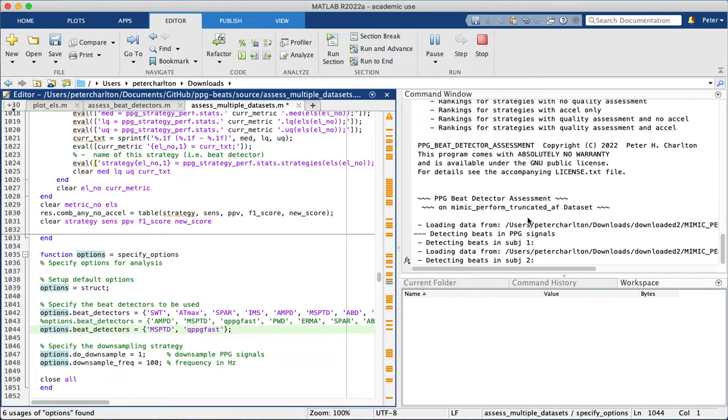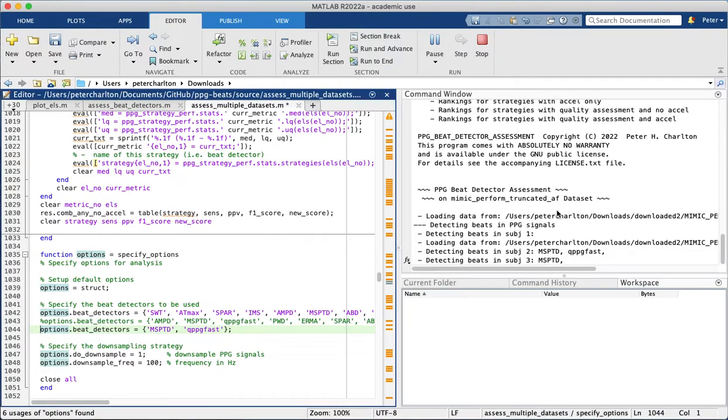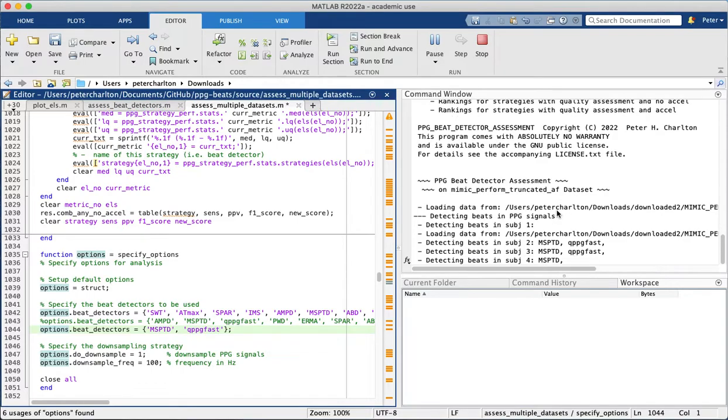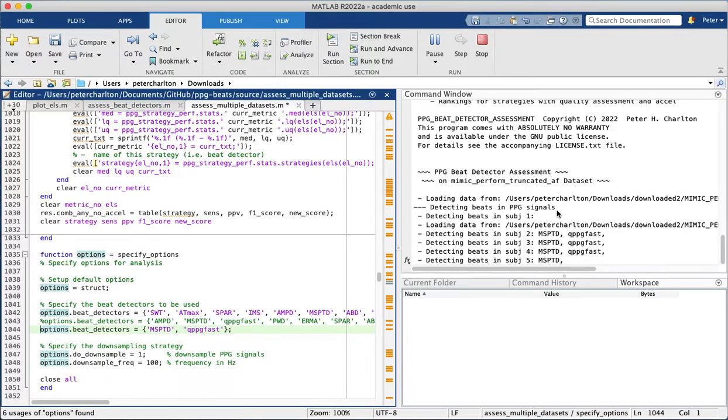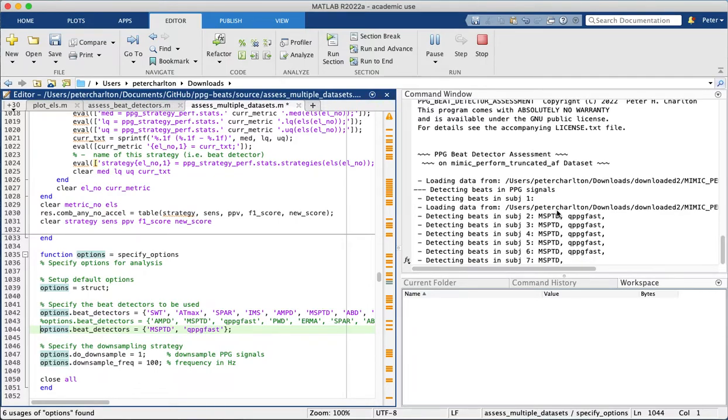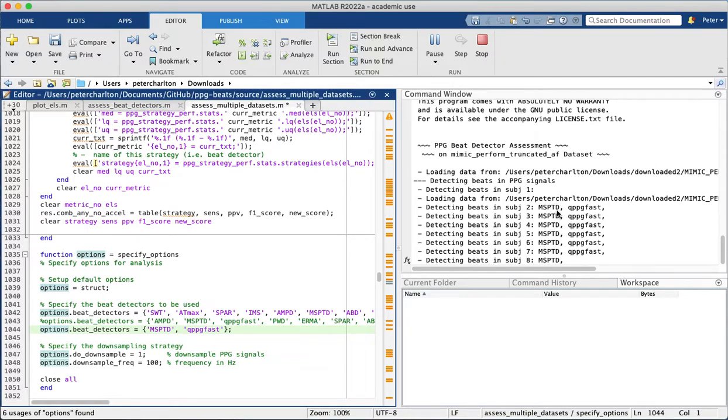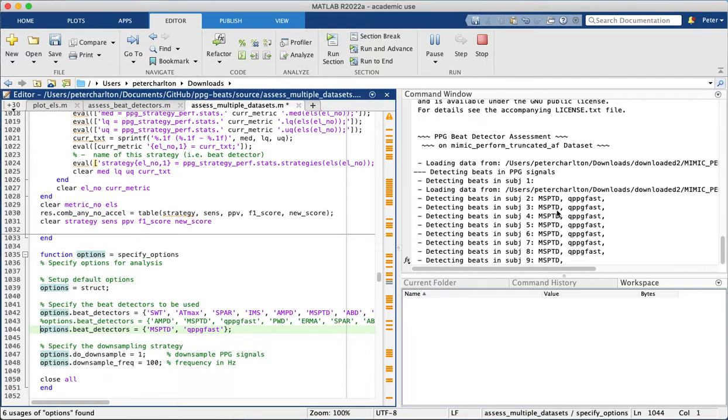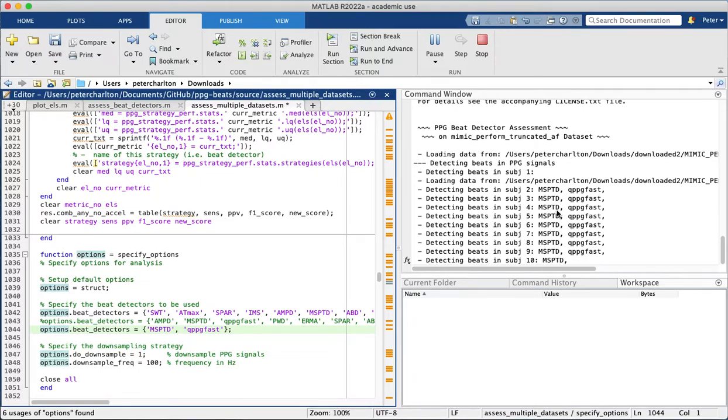So now it's moved on to the second dataset. So to explain what these mean: the first one was non-AF, non-atrial fibrillation, and that's patients in normal sinus rhythm. The second dataset is patients in atrial fibrillation. So these two allow us to compare performance between atrial fibrillation and without atrial fibrillation.